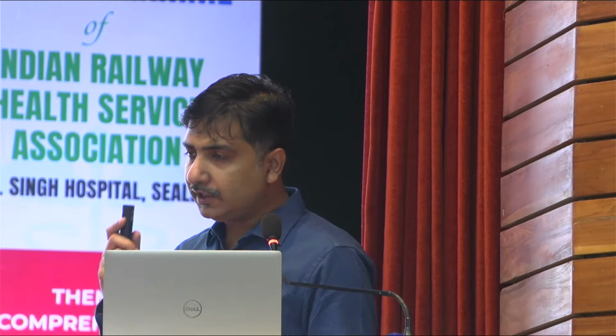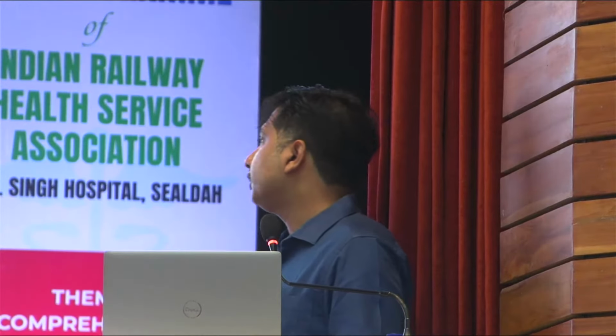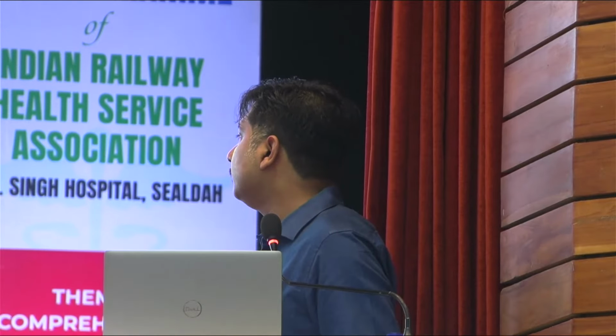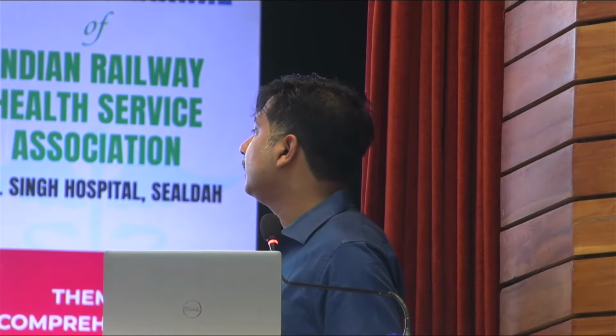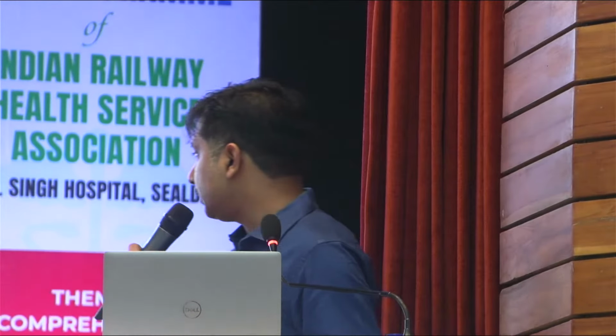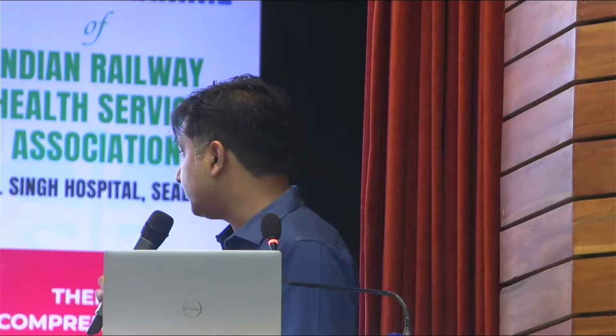And you can employ any of these regions. Now, whenever we employ the left bundle, we initially locate the tricuspid annulus. If we put a temporary pacemaker, then it is easier to locate the septal portion of the tricuspid annulus.